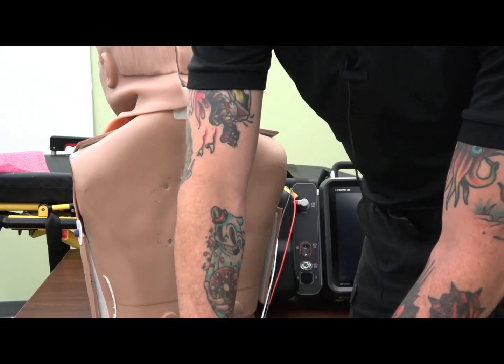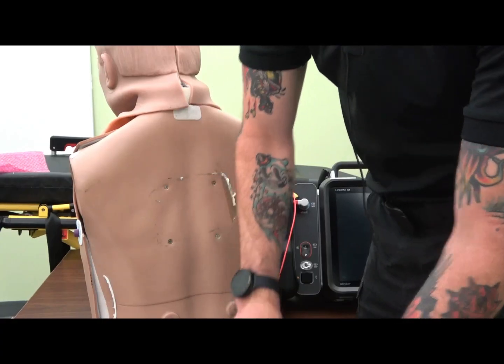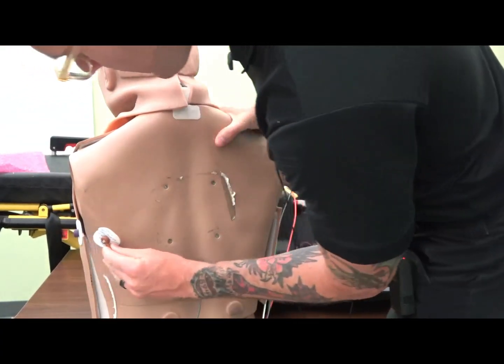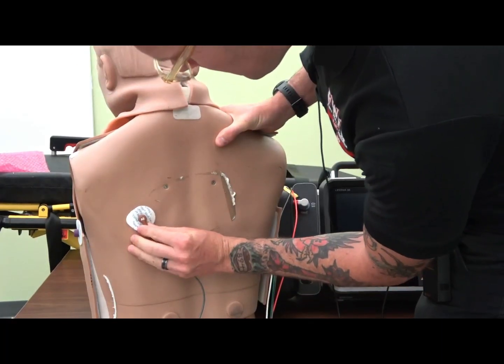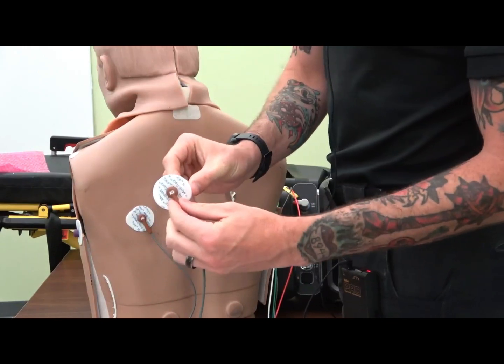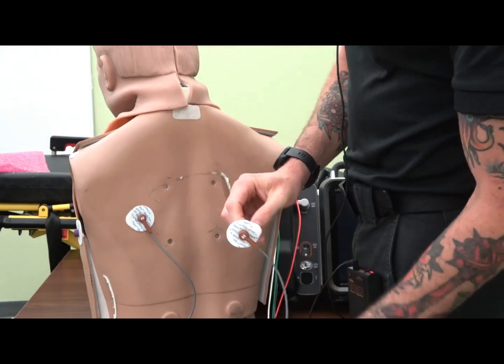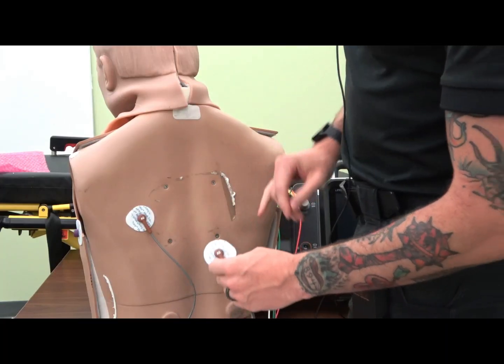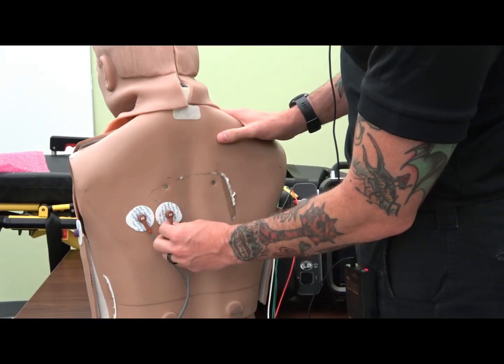My lead's sticking to things. All right. So same plane, mid-scapular, and then my A3 is going to become my V9, and that's going to be on that same plane, just to the left of the spine.